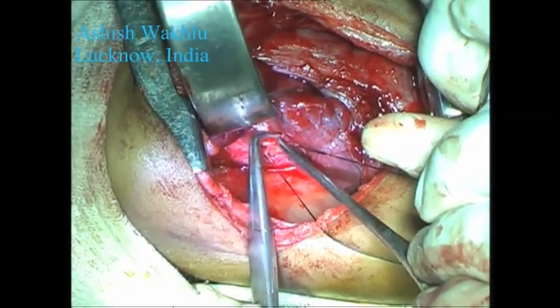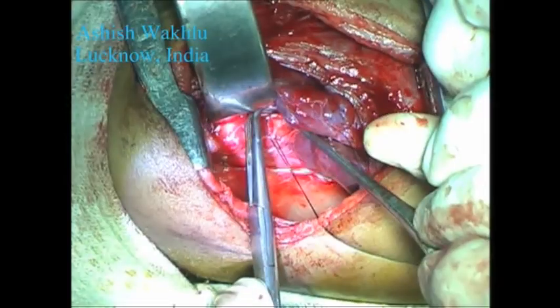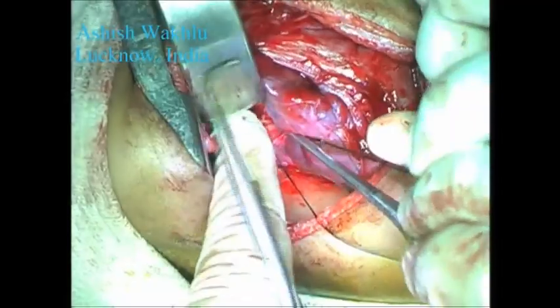From the amount of fibrosis which is present around the bronchus at the hilum of the right lung, it seems as though the obliteration of the bronchus has been due to an inflammatory process rather than being congenital.